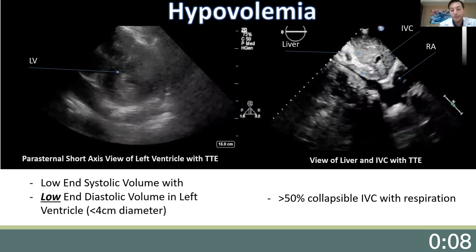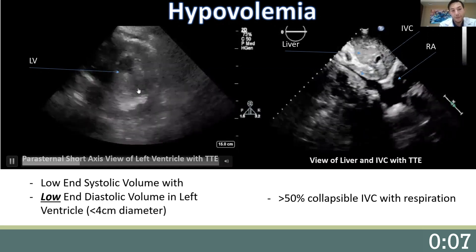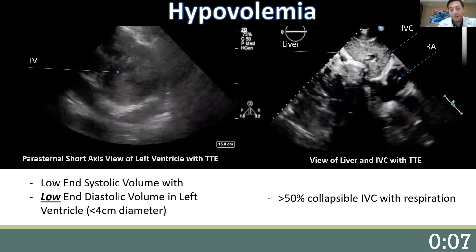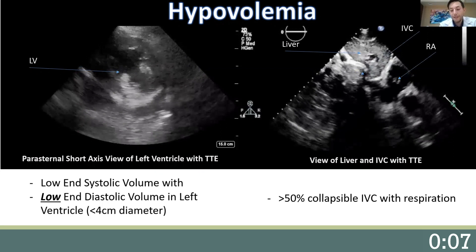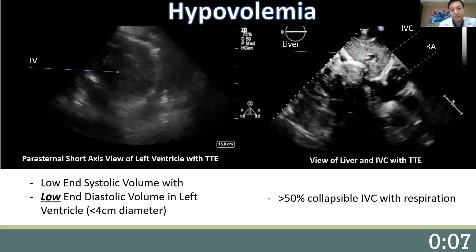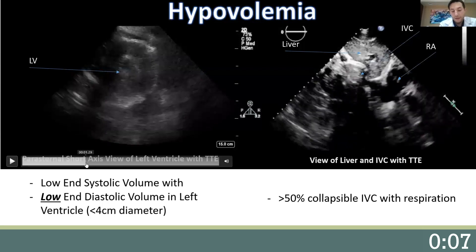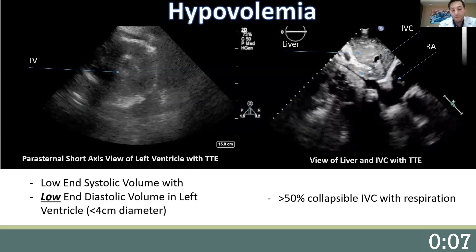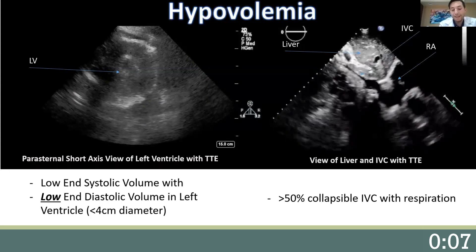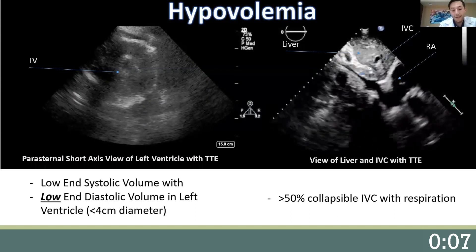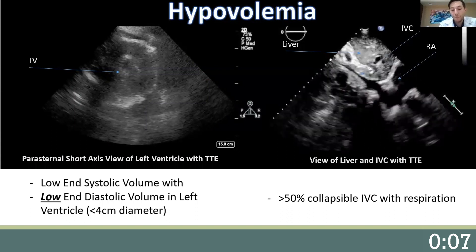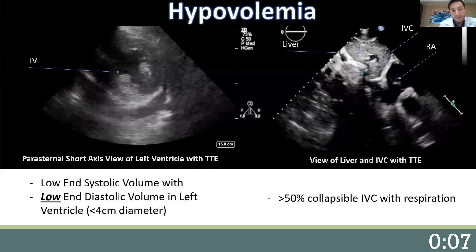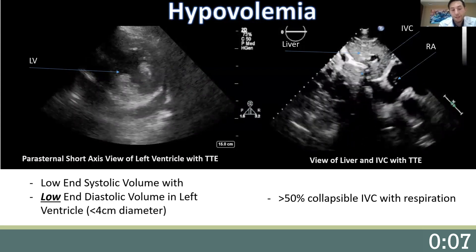On the left, we see a parasternal short axis view of a patient's left ventricle. To assess fluid status, we need to look at two things: end systolic volume and end diastolic volume. We can clearly see the patient on the left has a low end systolic volume — kissing ventricles seen here. This can occur as a result of hypovolemia or even low afterload. To differentiate, we need to look at end diastolic volume, which in this case is low. Usually an LV diameter of less than four centimeters suggests hypovolemia, which we can see here. So this patient is likely hypovolemic.